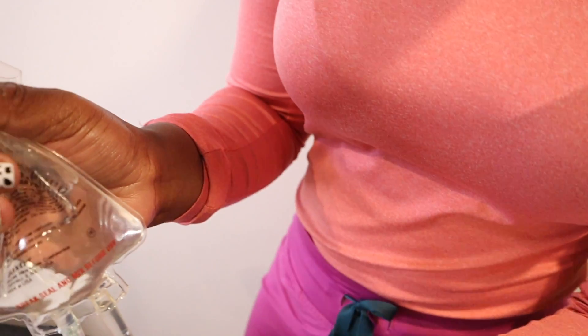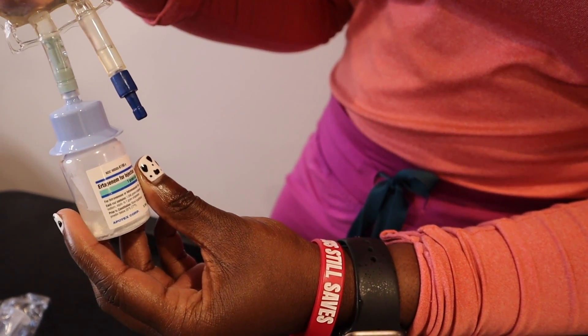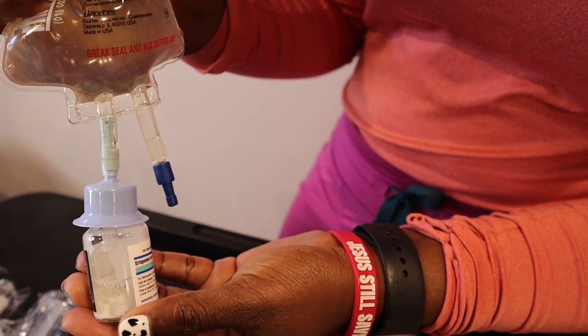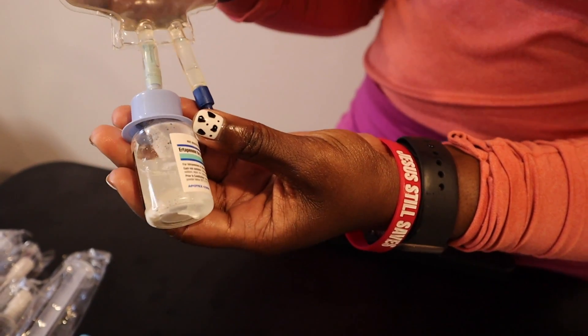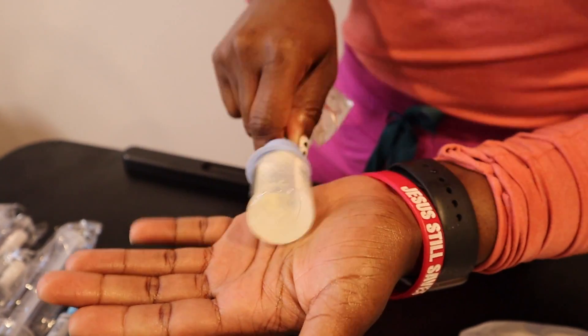Okay, so the seal is broken. Now we are going to squeeze the bag to bring solution into the vial, but we're only going to squeeze until the vial is half filled with the solution. We don't need to fill it the entire way, just enough to dissolve the powder. Okay, we have enough solution inside of the vial.